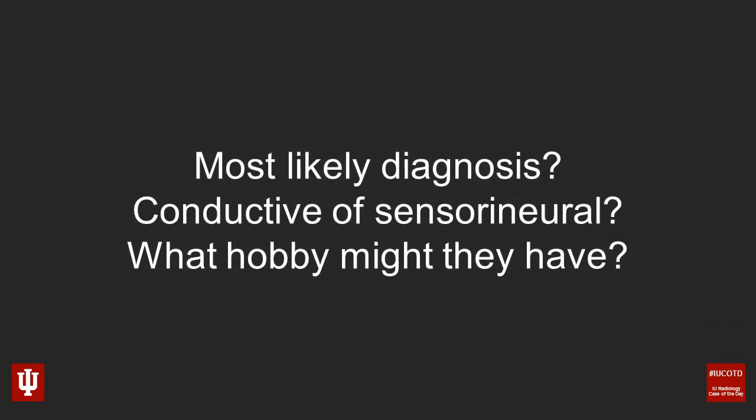Okay, so a few questions for you this week. First of all, what's the most likely diagnosis? Second question, do you think they have a conductive hearing loss or a sensorineural hearing loss? And then the third question is, what hobby or what hobbies might this patient have?